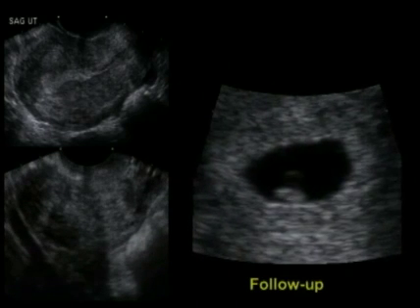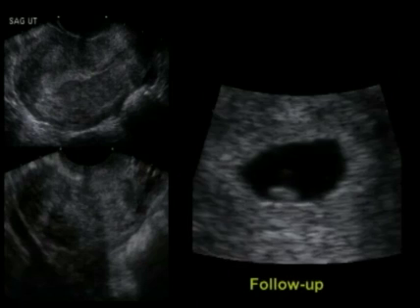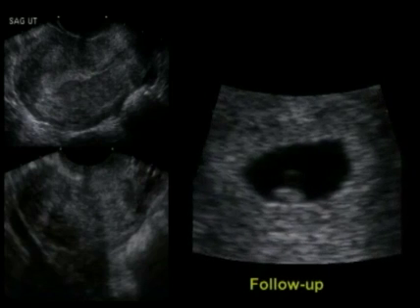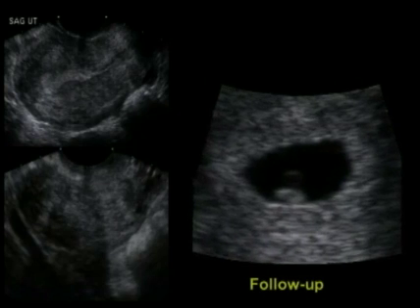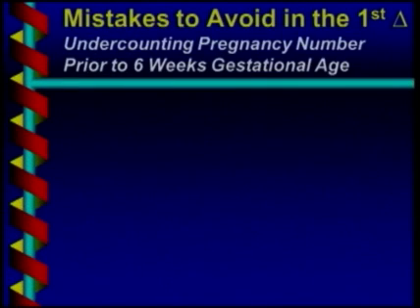And fortunately, we didn't give her methotrexate. She wasn't given methotrexate because we thought that this was a corpus luteum. And sure enough, on follow-up, she had an intrauterine pregnancy. It was just too early to see on the initial scan. So the way to avoid confusion between an intraovarian mass and an extraovarian mass is to push with the transducer and see if the mass moves with the ovary, in which case it's probably a corpus luteum, or moves separately from the ovary, in which case it's likely an ectopic pregnancy.